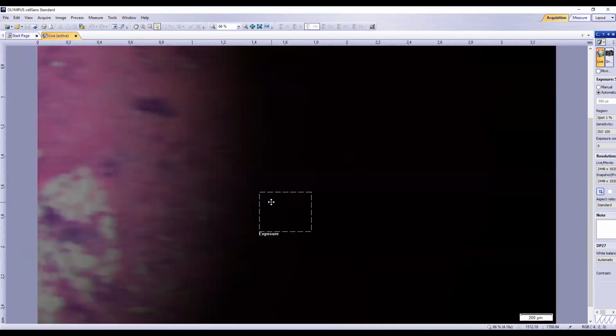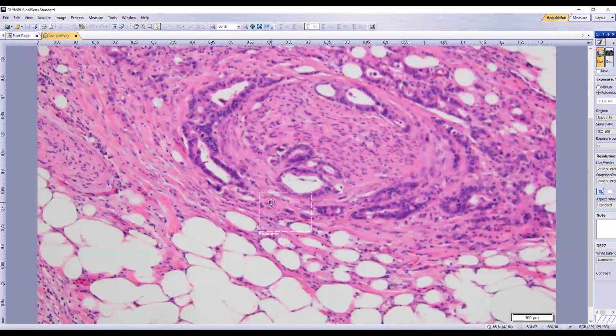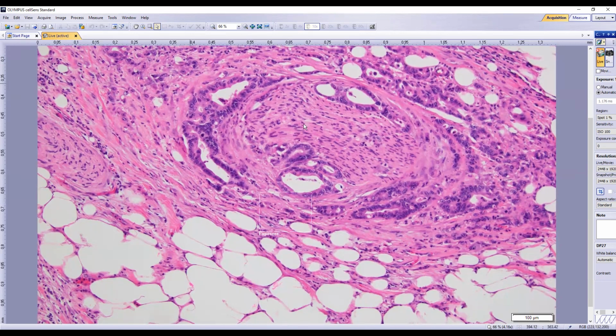Now there are 7 features of pancreatic cancer that, if present on a small biopsy or cytology specimen, are considered pathognomonic. These 7 features were classically highlighted by Dr. Ralph Hruban at Johns Hopkins, but eventually a lot of people mentioned this. One of the features is what we see here, perineural invasion, right? Perineural and intraneural.